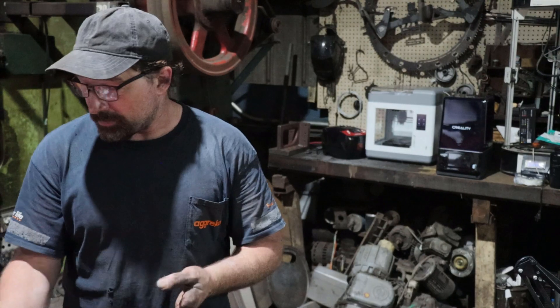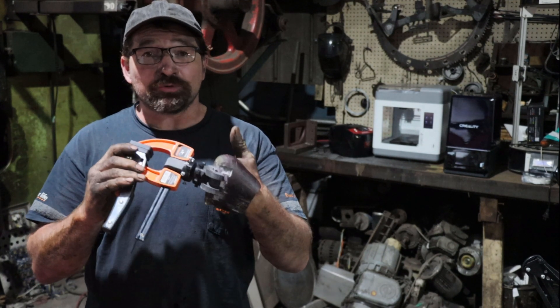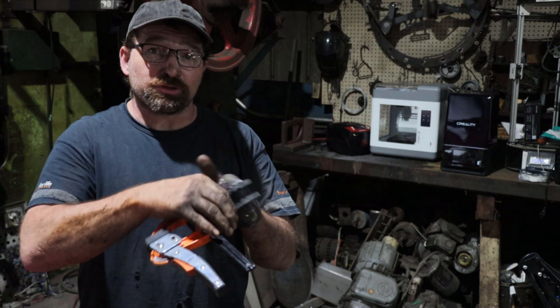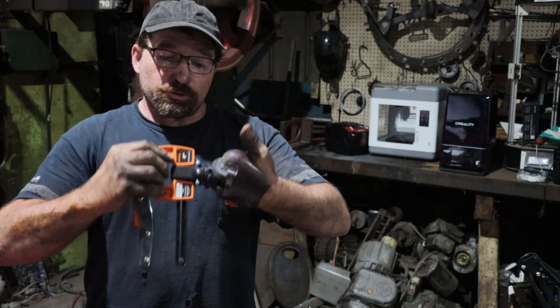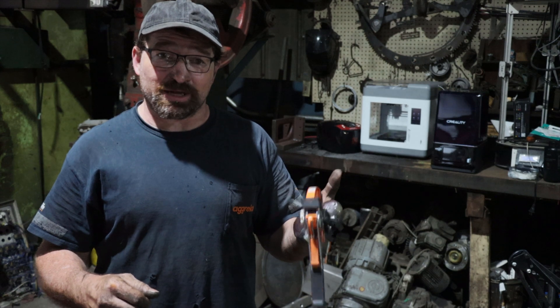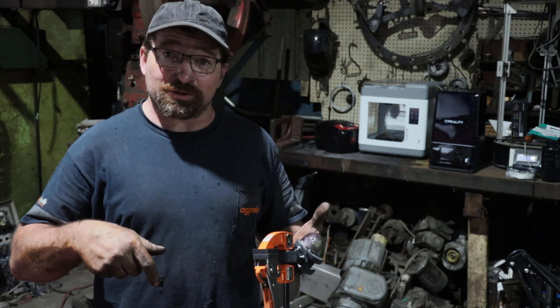The gadget I made is a 4 inch Jorgensen clamp mounted to a fiberglass socket. You turn this dial and the clamp locks every 30 degrees. When you push and twist, the clamp will lock every 22 and a half degrees. You can hold on to something with this gadget and run a grinder or a drill with your other hand.